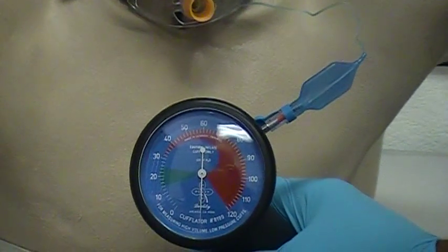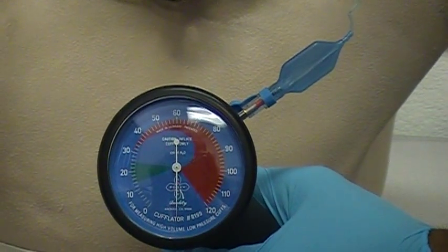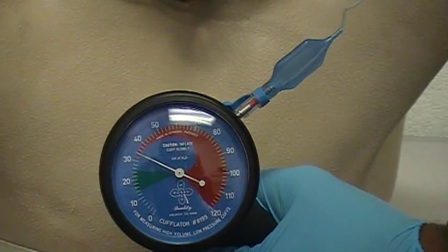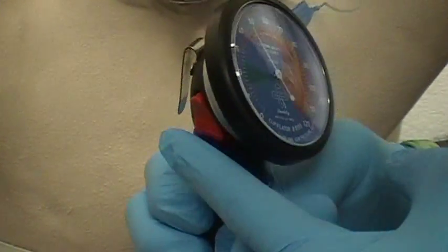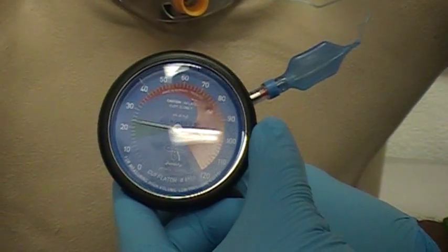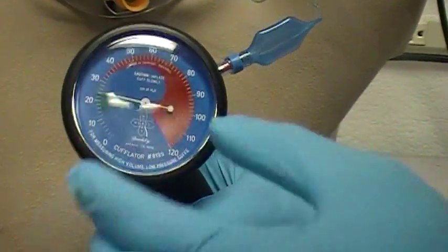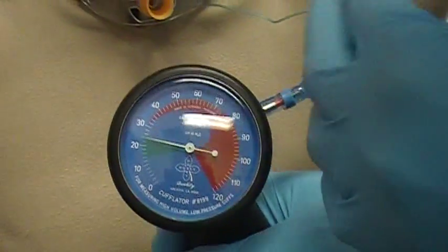You want to squeeze gently because, as I've done before, it'll shoot to 100 if you squeeze too hard. So gently. Good job. I'm going to back off now with this red button. I'm going to try to bring it down. Now I'm still in that green area, so that's about as much as I want to have in there. This way, like my associate said, we have room for leakage.